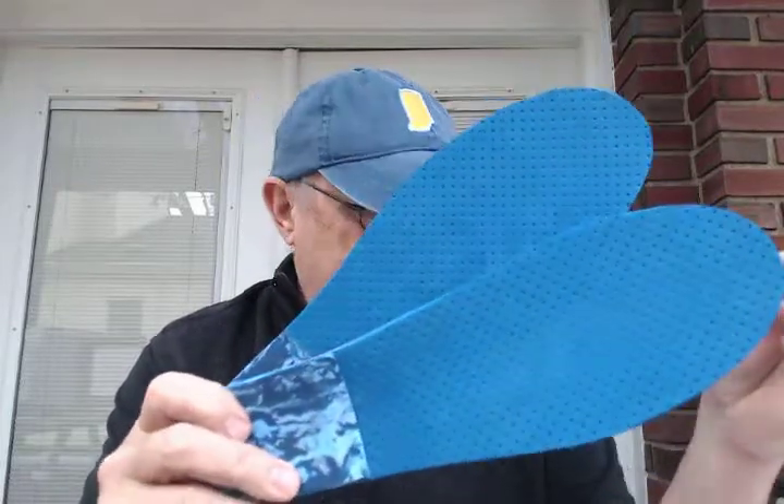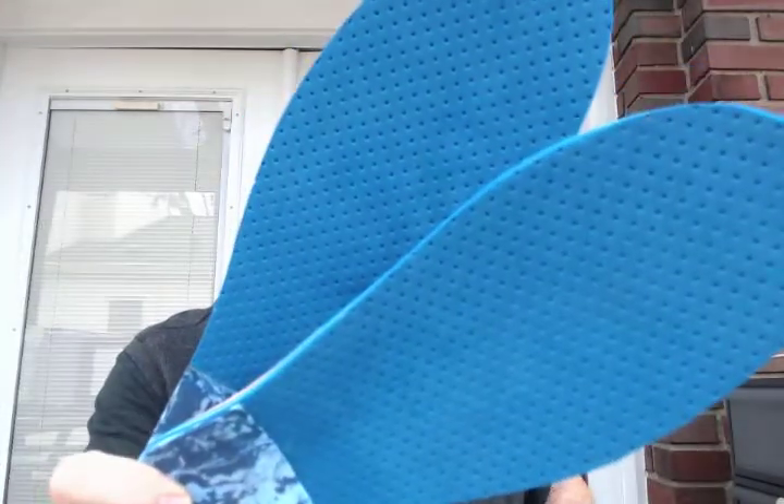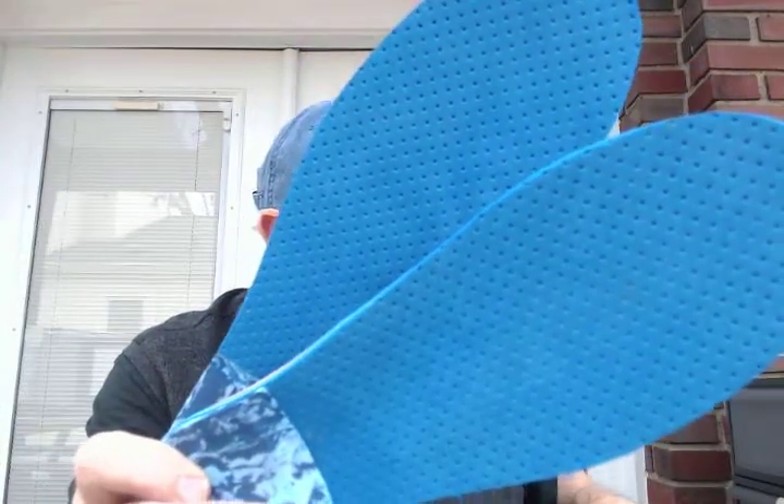Hey, it's Clyde, Indiana Brace. It's March 31st, 2017. I've got a pair of my heavy-duty foot orthotics going out to Robert in Plainfield, Indiana. I use several different types of materials.